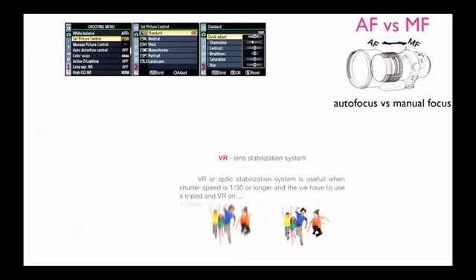Then, I was telling you about the autofocus option. I'm never using manual focus, because I always have good light inside the room where I'm working. No matter if I'm in a studio or in the laboratory, I always have good lights, and then I leave my camera to do the focus for me. It will be much faster than manual focus. Manual focus we usually use when we shoot from a tripod, when we shoot insects or bugs or different kinds of things like that, but our patients usually are moving and we need to have a very fast autofocus.